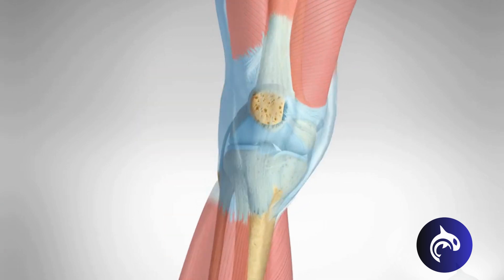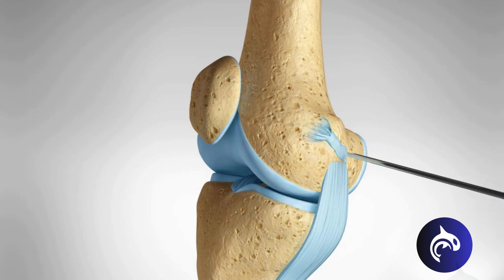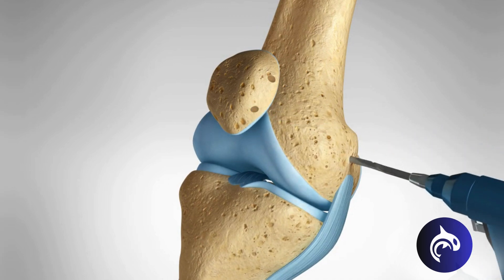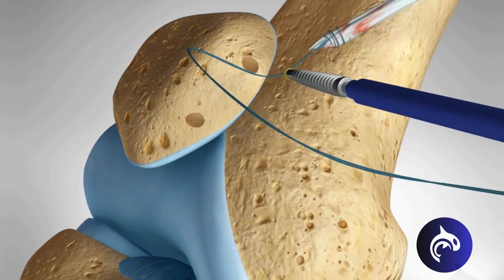Severe tears and recurrent dislocations often require MPFL reconstruction. The damaged ligament will be removed. Two small holes will be drilled on the medial side of the kneecap and one on the femur. The new ligament will be secured in these holes with screws.